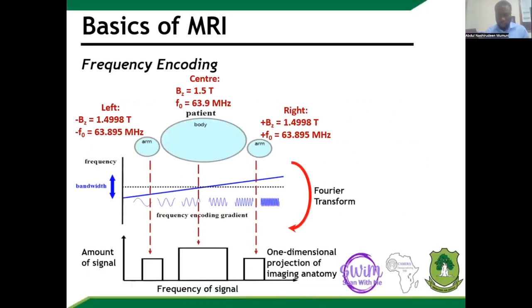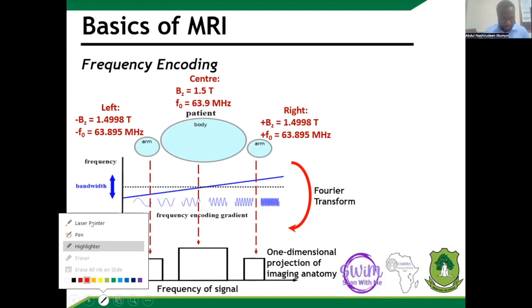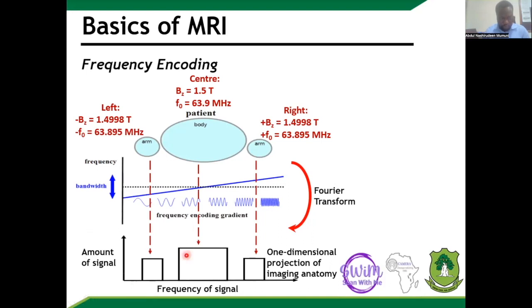So you can see here the human body lying in the scanner as though you are looking at the person from the feet facing you. So the body is the middle portion, the arms are to the side of the torso. And so you can see at the bottom here, each of the, let me see if I can get my pointer. So each side of the histogram here maps to the size of the anatomy of interest and position as well.